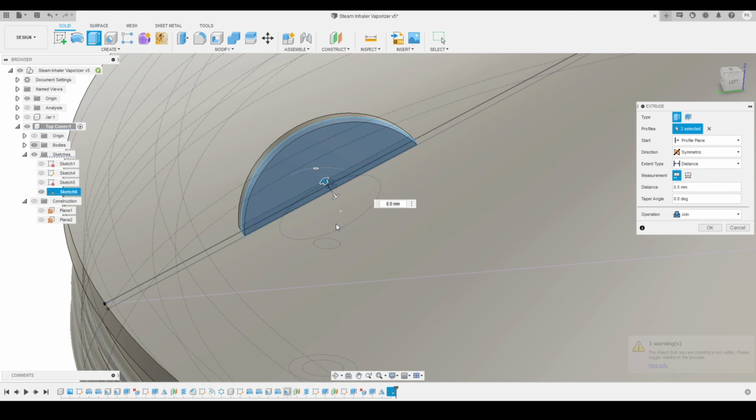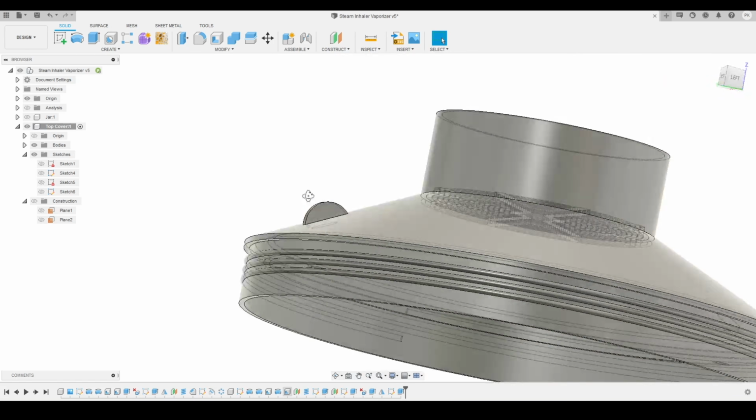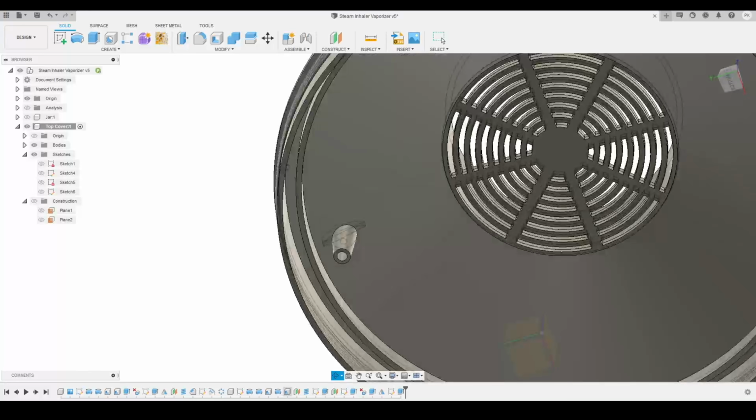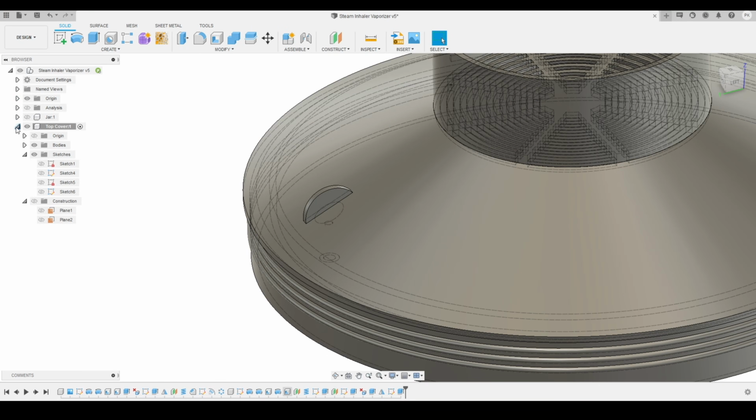Here you can see, and I'm going to extrude this in symmetric direction, and we'll make sure that the operation is joined. And now if I turn on my body, here you can see it is getting joined and created. So this is what we had created just on the top of the mountings that we had created on the other side.